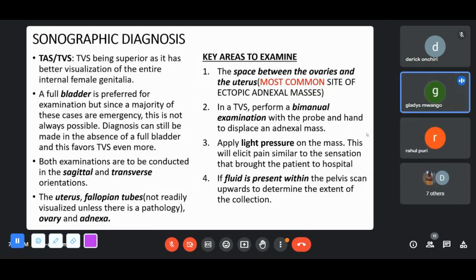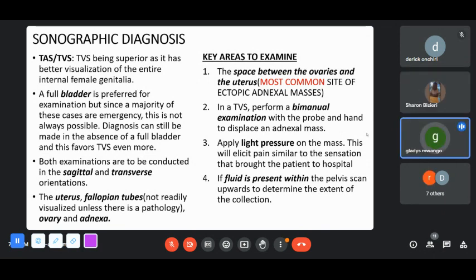Yeah, it can be tricky, especially if the patient is obese. If it is in late pregnancy, was it in late pregnancy? No, doc, it was the second trimester. Second trimester. Okay. Sometimes in late pregnancy, there's an additional fat that is added at the lower abdomen, suprapubic. So that makes it even more difficult.